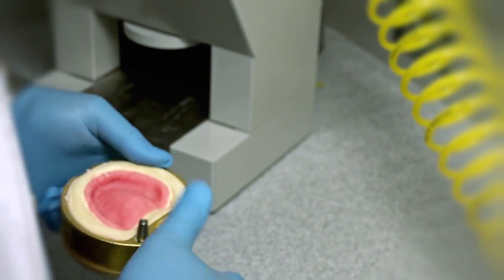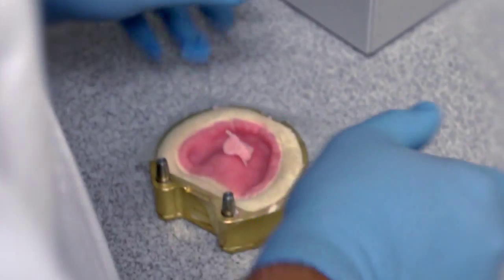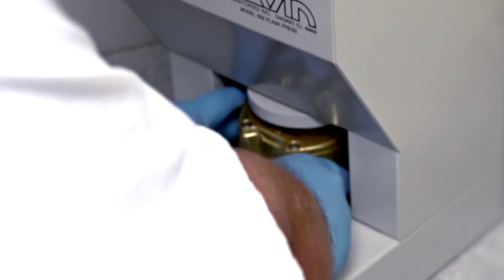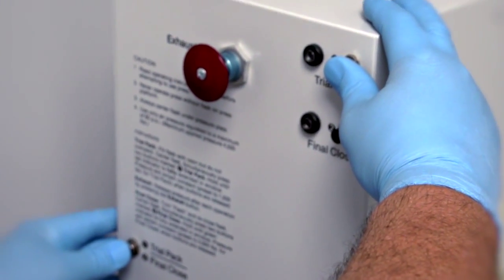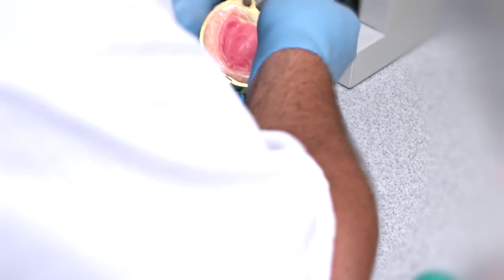I'm going to trial pack this one more time. I'm only going to use 1 sheet. Put it back in the press, center it, press both number 1 buttons at the same time. And right here we'll see the red indicator light, and when that comes on we know it's at the optimal pressure.